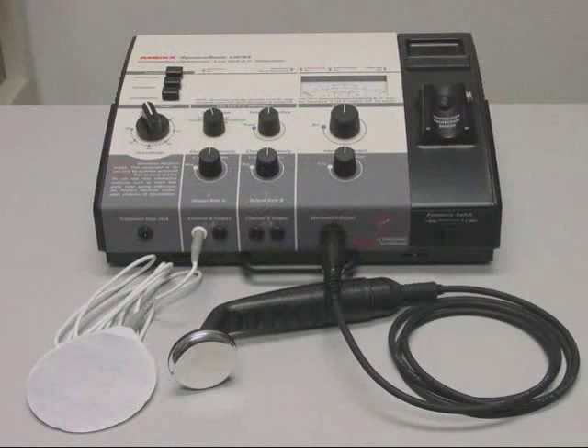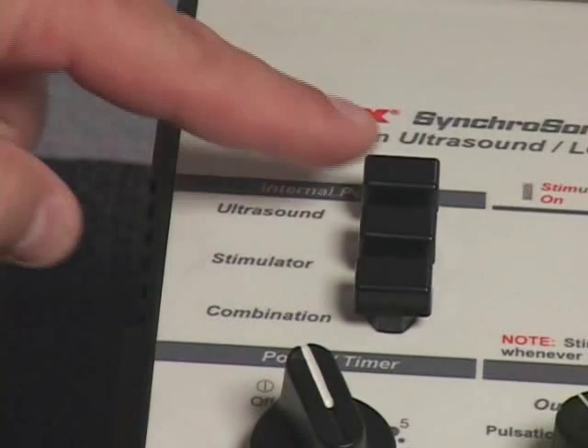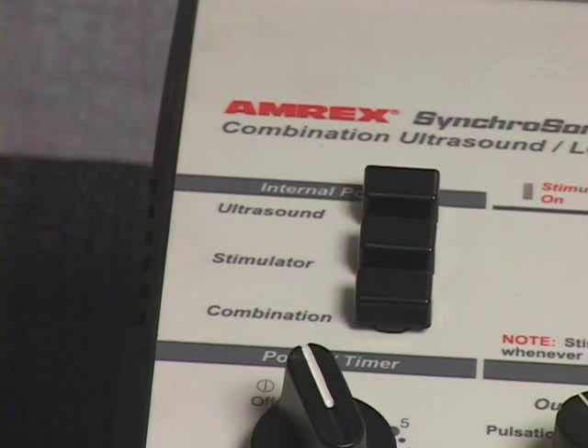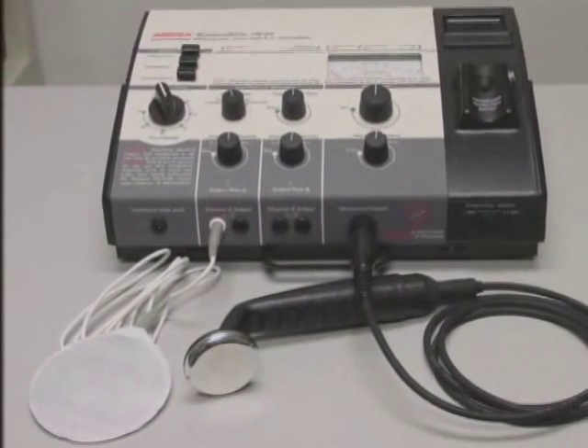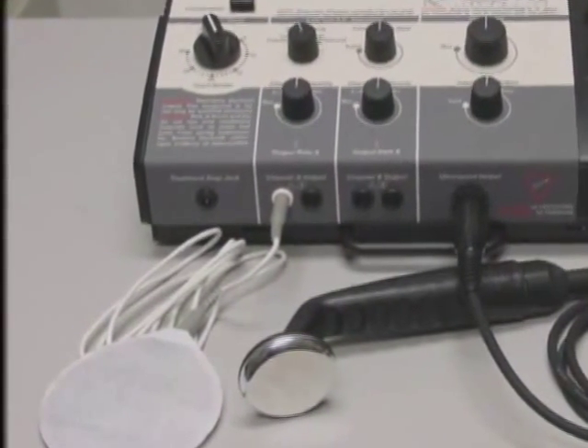Combination therapy is ultrasound and a stimulator modality applied through the ultrasound transducer simultaneously. Depressing the US54 internal power ultrasound stimulator and combination switches to the on-down position, and properly connecting a dispersive pad to the white stimulator output jack will enable combination therapy.